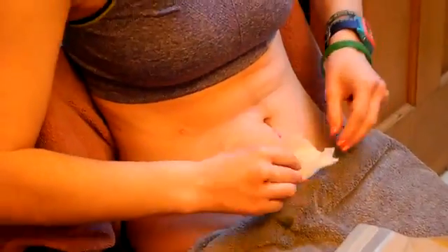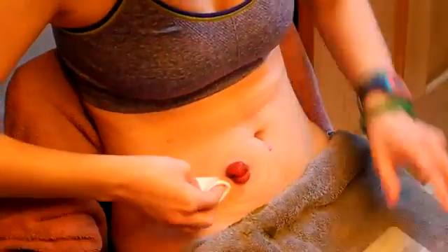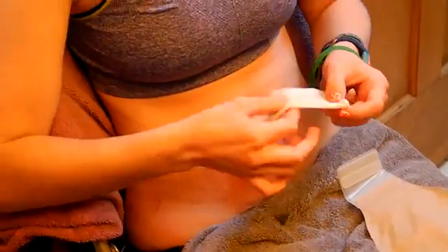So you just clean the skin off, no big deal, a little bit of stool on my hand, but you know, you learn to deal with it. By the way, I think it's good to mention that I was extremely germophobic before I got my stoma, especially about bathrooms, and now look at me, I'm playing in my own poop.